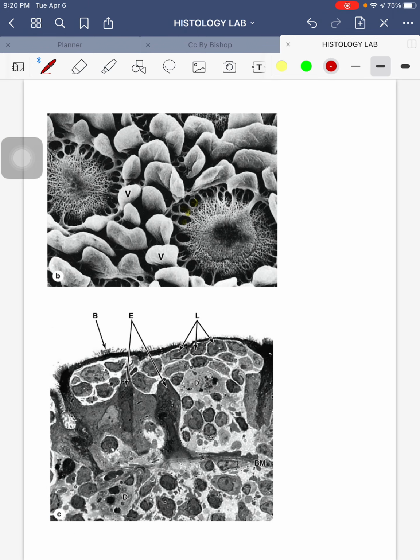So here, it's very hard to appreciate this since this is an electron microscope. But the porous areas here, this is a villi. So for example, there's a goblet cell here. It will help you understand better. Okay, so it will be taken in slowly, since remember columnar cells, they also absorb. And then the M cell, let's just say this is the M cell.